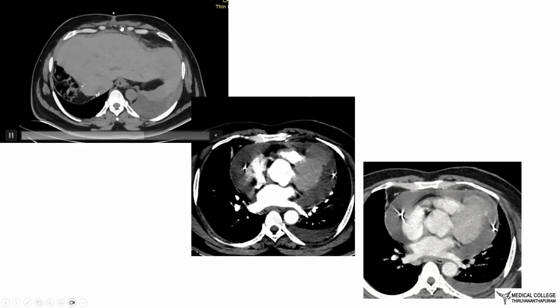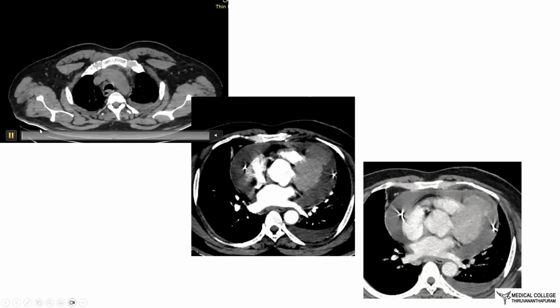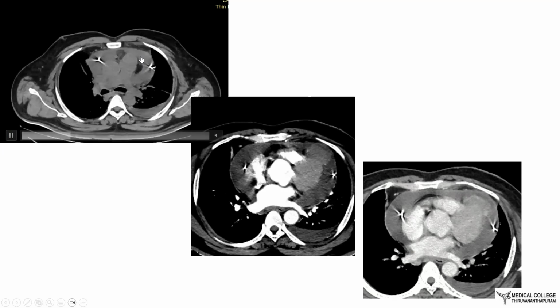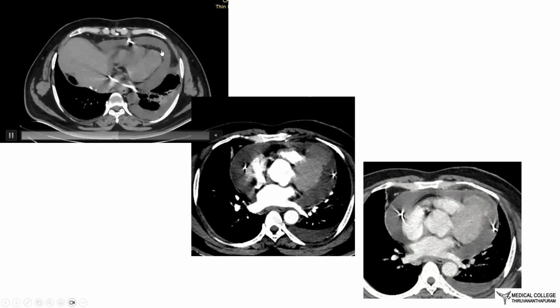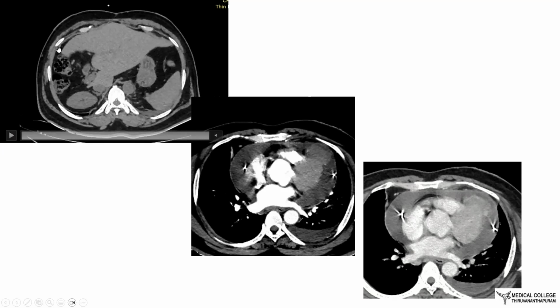The patient underwent an emergency pericardiocentesis, and then echo was done for evaluation of the hemopericardium. In echo, they did not see any underlying lesion. If you see, this was the post-surgical liver as well that is seen.